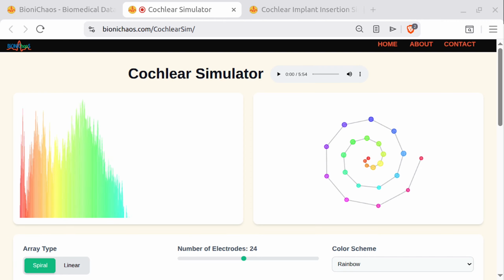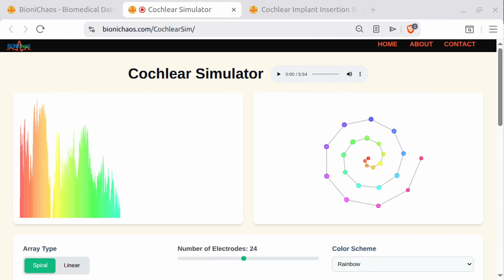It's an enforced dual existence. You have to remove the external processor to swim. You have to take it off to shower. You have to remove it to sleep while those batteries charge. Every single night, the light switch is flipped off. To sleep peacefully. But if your child cries in the next room or a smoke alarm goes off, you cannot hear it. That creates a stark vulnerability that naturally hearing people simply do not possess.